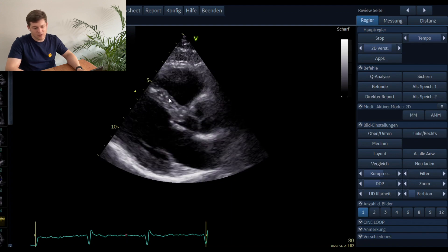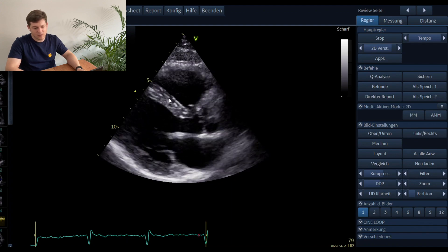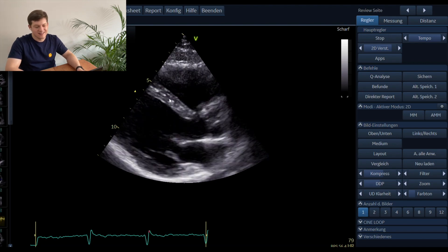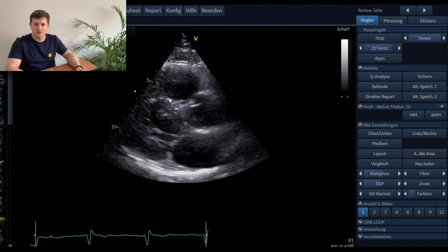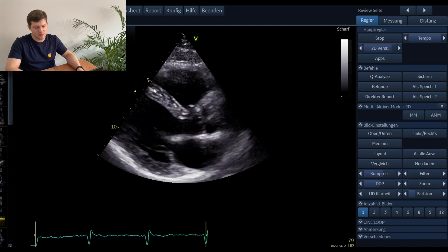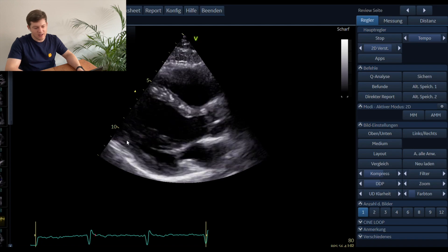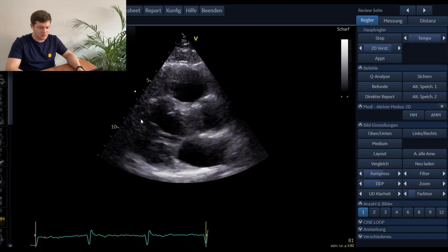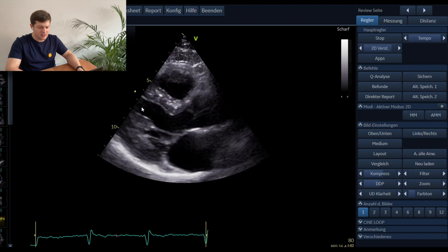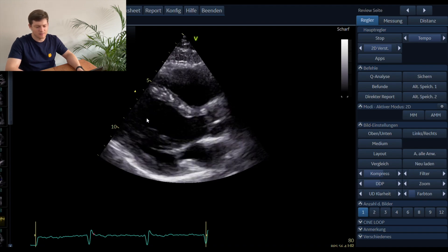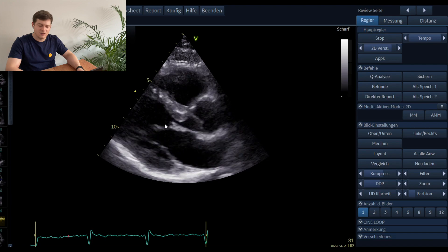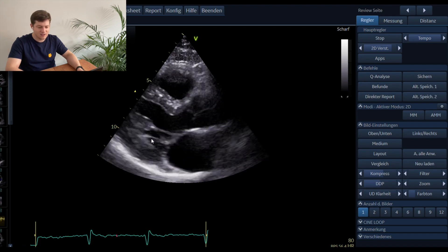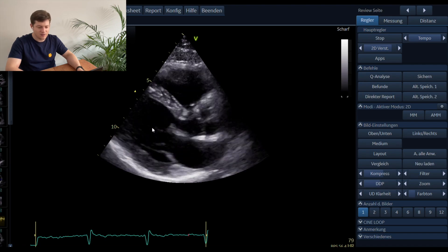We see here the interventricular septum. In this patient, because it's a young healthy individual, the interventricular septum is thin — so no hypertrophy is seen in this image. Here you have the cavity of the left ventricle, and you can see the papillary muscle.